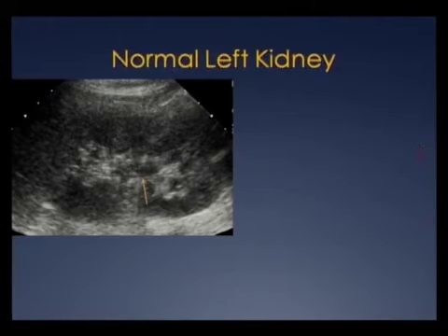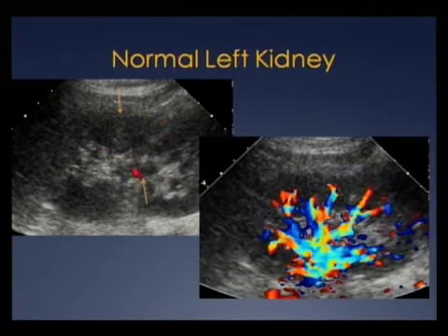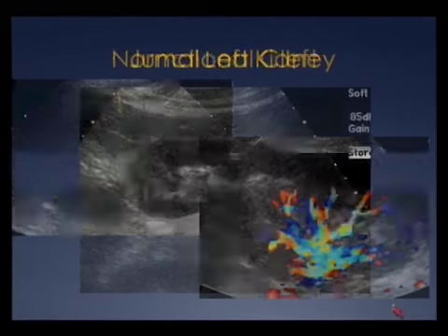Moving on to the kidney. In the kidney, we frequently may confuse this with dilated renal pelvis, and this is the left kidney, so I'm actually trying to show you a dromedary hump here. But remember to apply your Doppler, because a lot of times these hypoechoic foci that look like pelviectasis or mild hydronephrosis in the kidney are actually just blood vessels. And again, a dromedary hump would have normal vascular flow. The flow would not be displaced around it or disorganized.